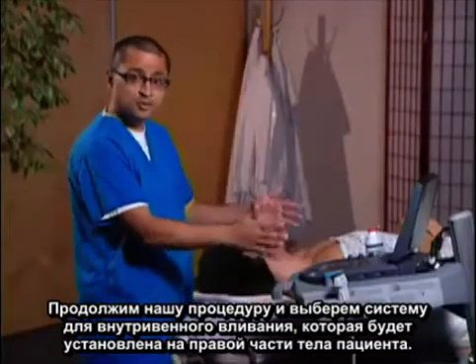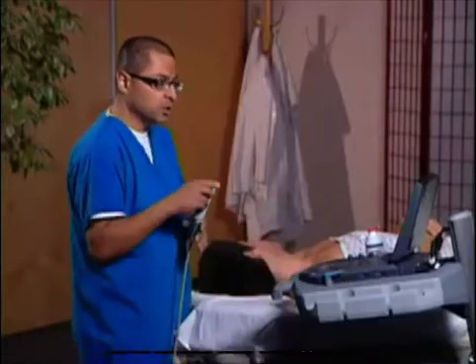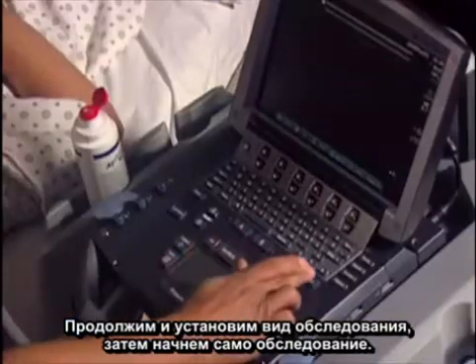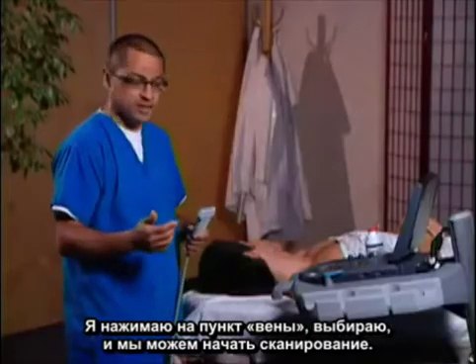We're going to go ahead and choose our system, which is going to be placed just to the right of the patient. We're going to use a linear transducer. We'll set up our examination type — I'm going to hit exam, click on venous, select, and we'll be ready to start scanning.